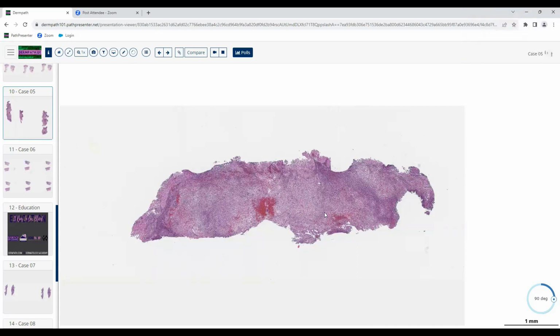Mostly lymphocytes? Well, some may be lymphocytes, but do they look quite as jet black? They're not as dark. When they look a little bit lighter, now they don't look like the histiocytes we saw in the very first one either, right? It's like different. Kind of looks maybe like salt and pepper, if you want to think that way.